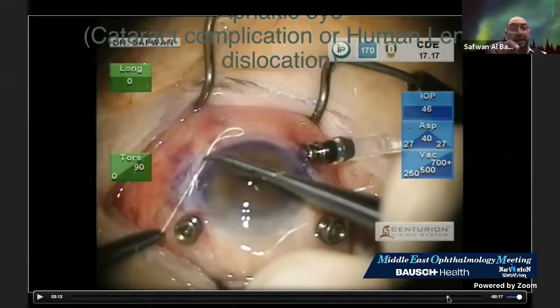That's why here I need to stop, because Ashwin mentioned one thing related to the mobility of the lens, that when the human being turns his head, the lens will move with it. I don't think that's true with the Gore-Tex suture.